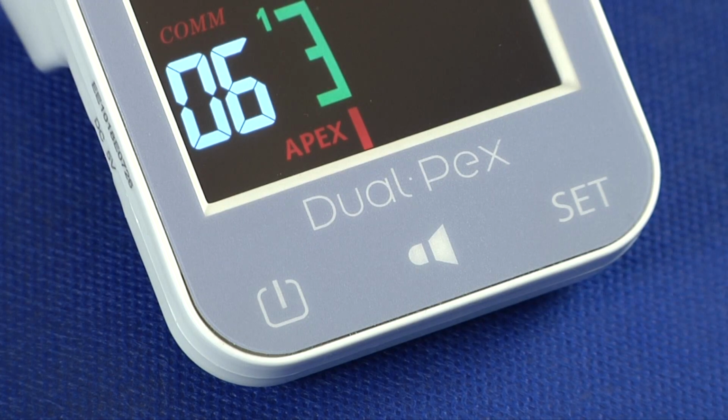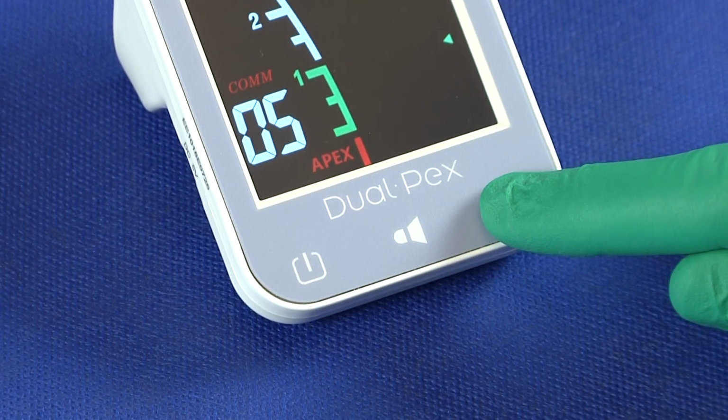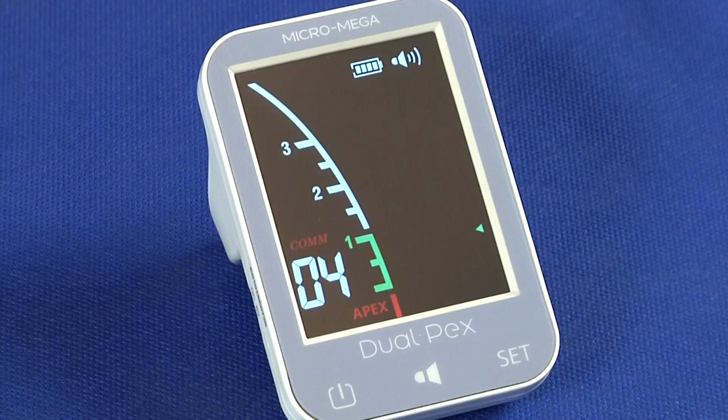Main switch to turn on or turn off the device. It automatically turns off if not used for a while. Volume setting key. Set key to adjust the position of your own apical limit, called the reference point.